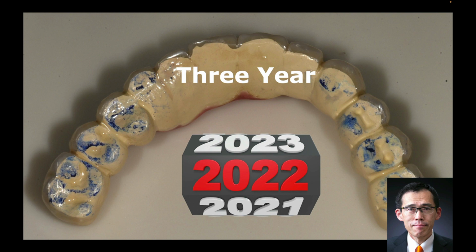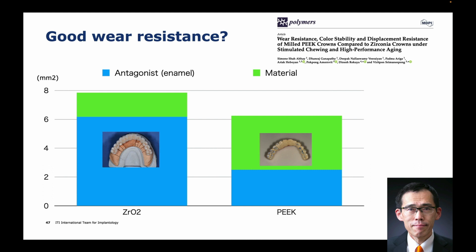After 3 years, the occlusal surface is PEEK, but no major wear is seen. Polishing of the antagonist prosthesis is essential. I have seen PEEK wear due to lack of antagonist polishing. In this paper, Abu Hai reported that PEEK does not wear out enamel as antagonist more than zirconia.